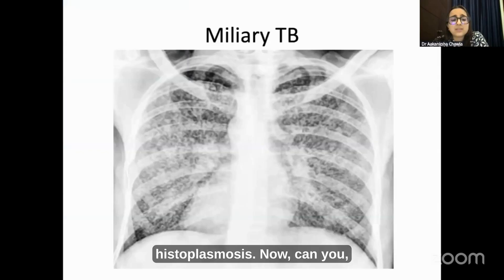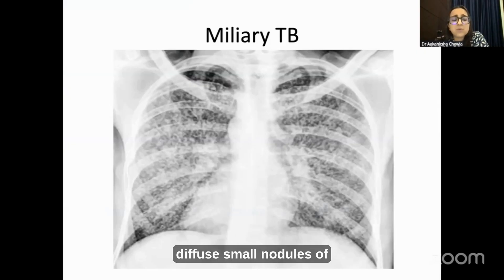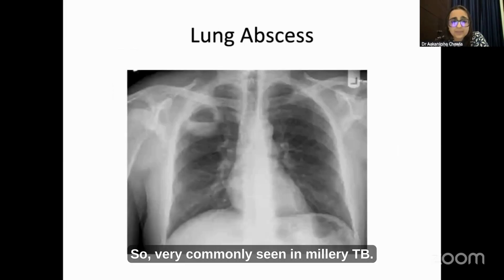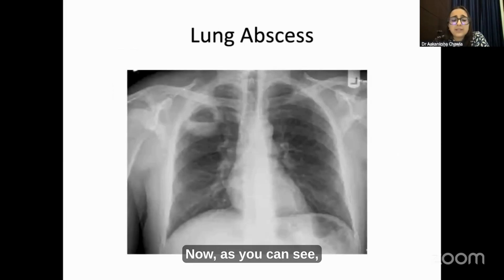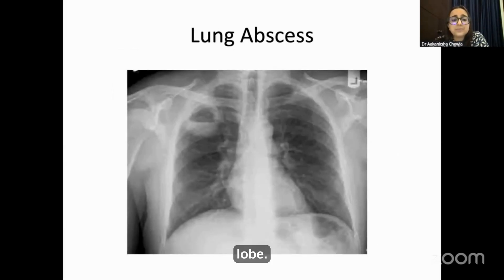In this X-ray you can see bilaterally diffuse small nodules of 1 to 3 mm in size — very commonly seen in miliary TB. The following X-ray shows a lung abscess in the right upper lobe.